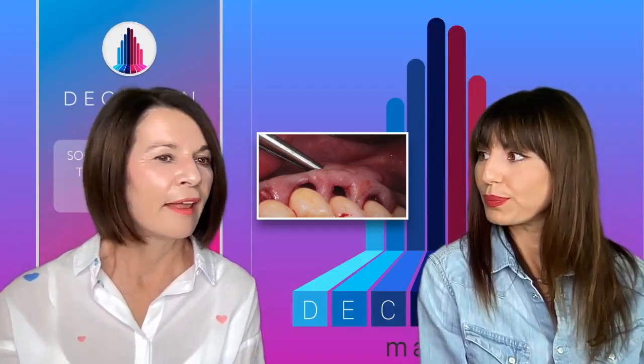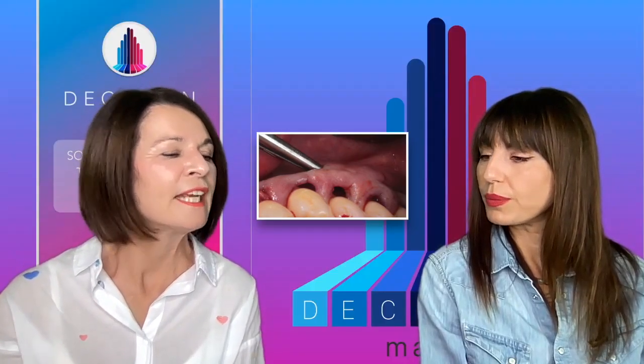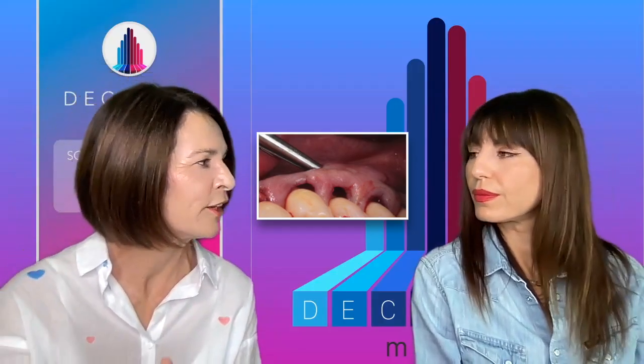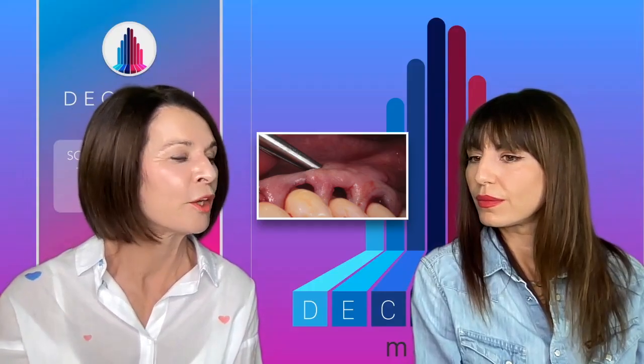And this way we get great flap mobility. This is what I mentioned. This is how I started with recession coverage. It was a coronally advanced flap, but without periosteum releasing incision, but we undermined the periosteum all the way above the mucogingival junction and laterally, mesially.